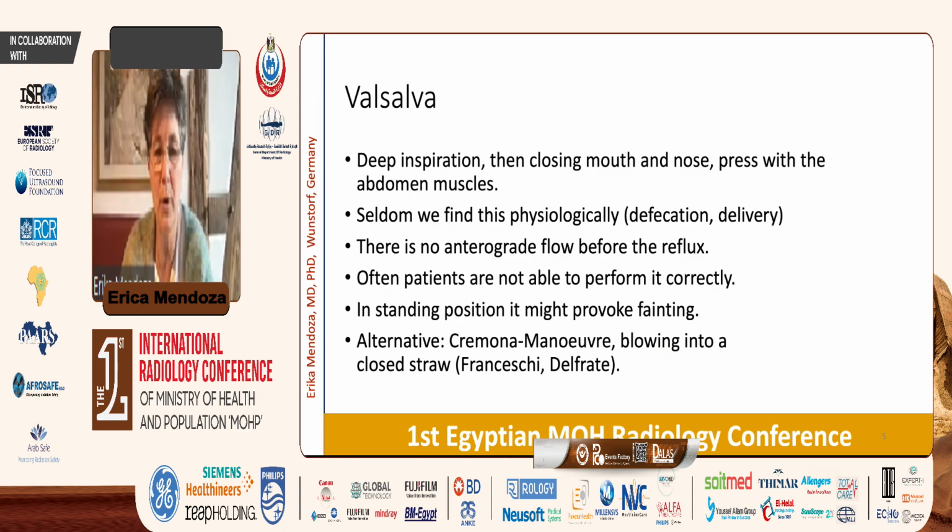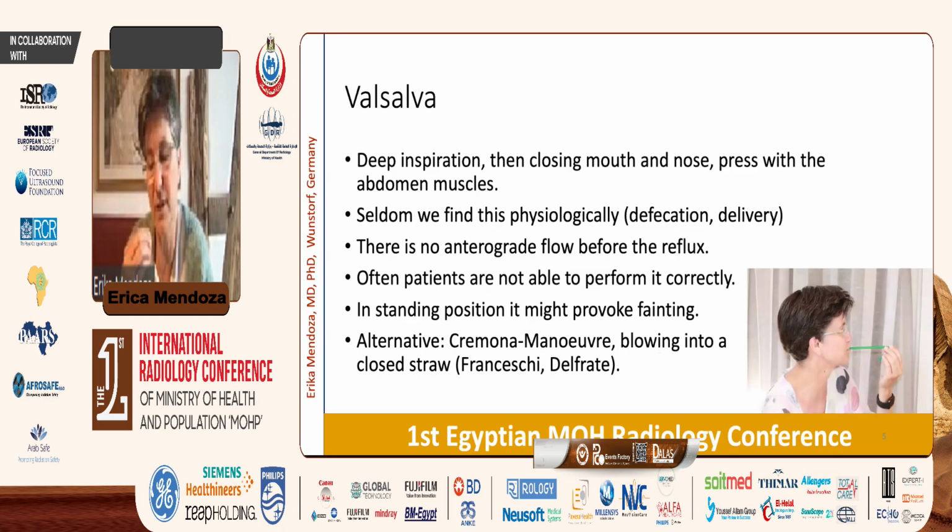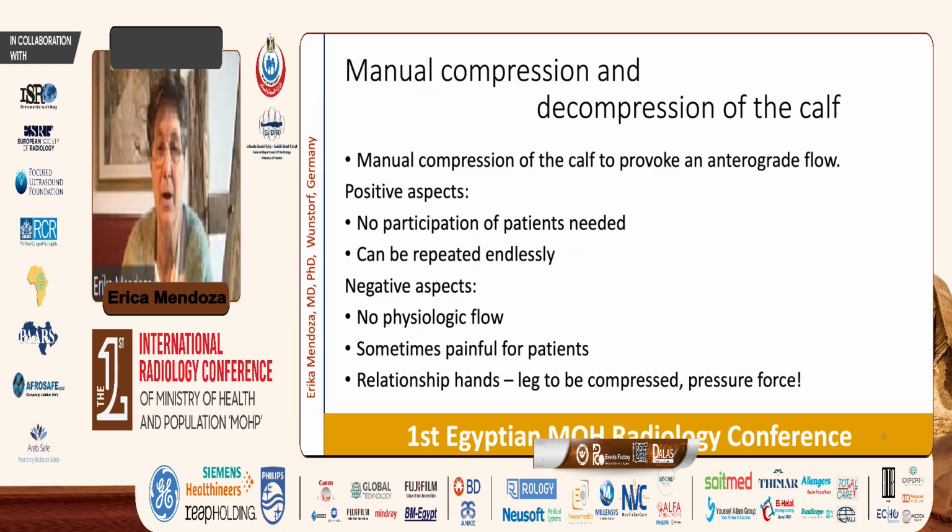Valsalva, you all know it, and as I told you, blowing into a straw is really a good option to have a continuous, same pressure, and the people aren't fainting, because if you do Valsalva on a standing person, after 3 or 4 times they are fainting and I can't stand it. The manual compression and decompression of the calf is surely the most often applied, also by me, because I can talk to the patient in the meanwhile and I can go on with my exploration, and the patient doesn't have to understand what I want from him.